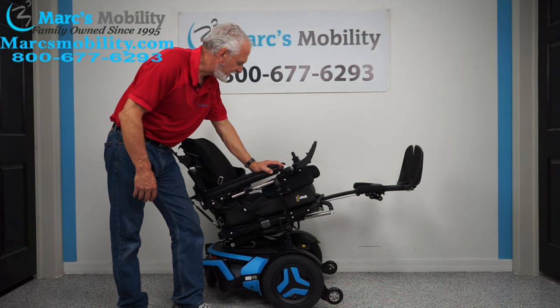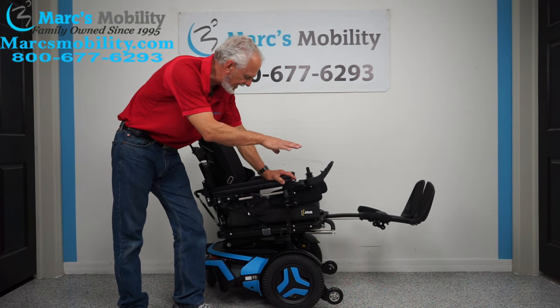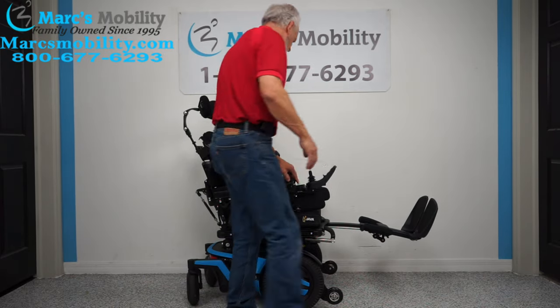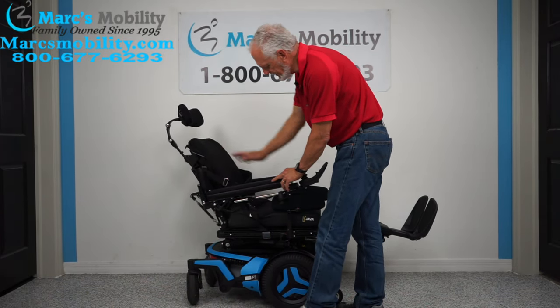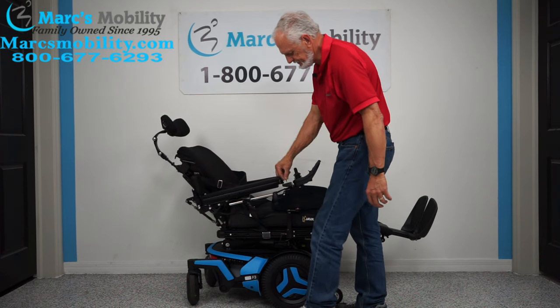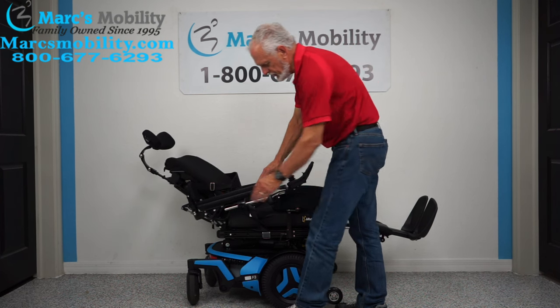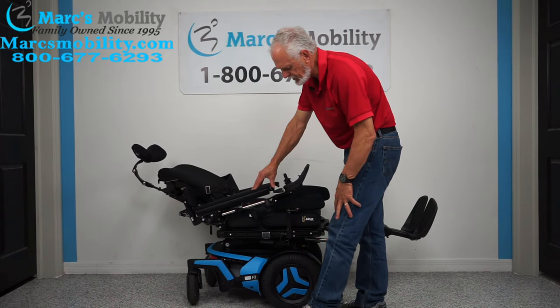I'm going to bring the tilt all the way back down. So far we've covered the electric legs, the electric tilt, and the 12-inch seat lift. Another thing you have on this chair is called the electric recline. You see the back going back by itself? Nothing's moving but the back — that's called the electric recline. Also on this chair, notice you have elbow pads — that's custom and usually not on these chairs.